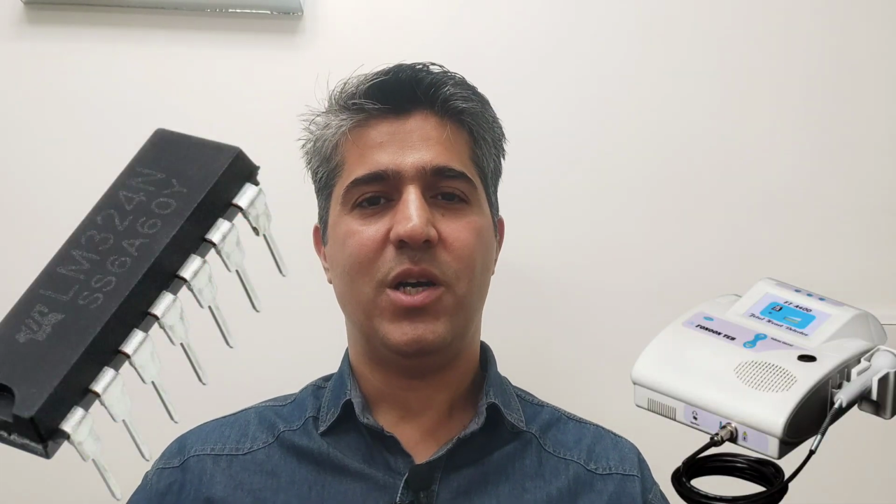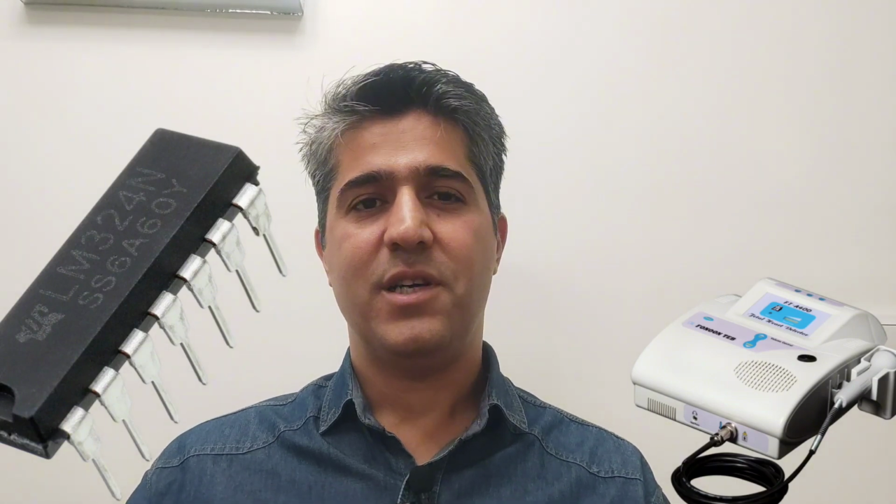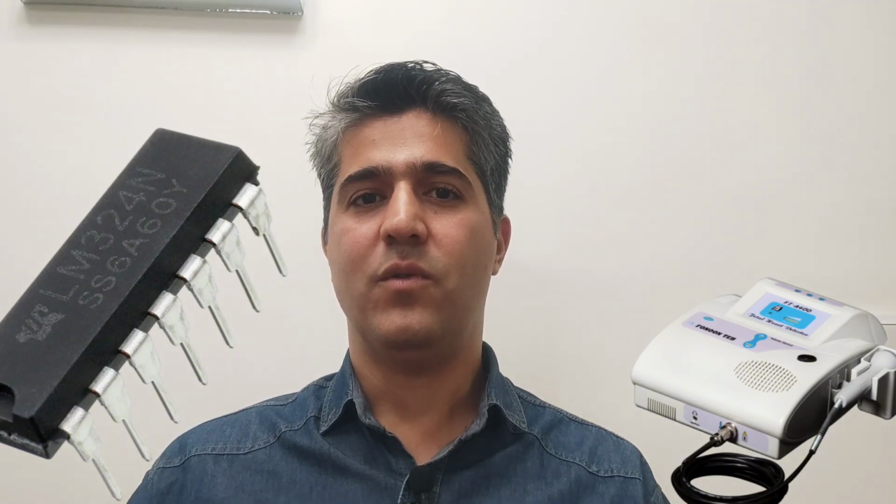In this video I'm going to talk about op amps and the popular IC LM324. Stay with me. I'm going to explain the operation of op amps and one of the most widely used op amps in electronics, which is used in many boards. And at the end, I will deal with the troubleshooting of a SONOKID device whose op amp was damaged.